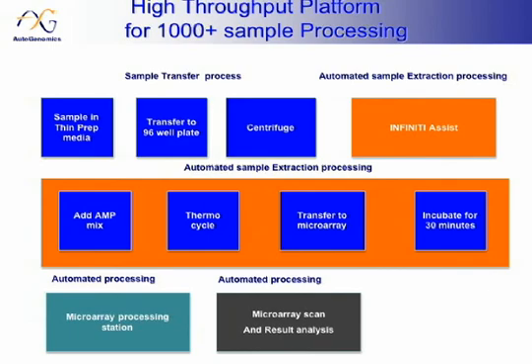We then decided that the current system which we have, which only scans 1 microarray at a time, was not capable of handling 100 microarrays at a time. So we developed a scanning method which would scan 100 microarrays. And now remember one thing, each microarray has 6 patient samples. So if you can scan 100 microarrays, then you can have 600 patient samples ready to be reported on. Okay.